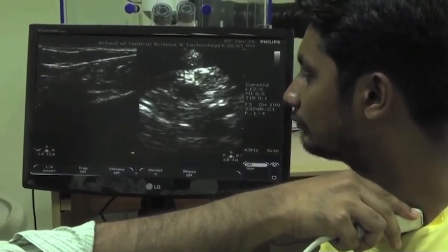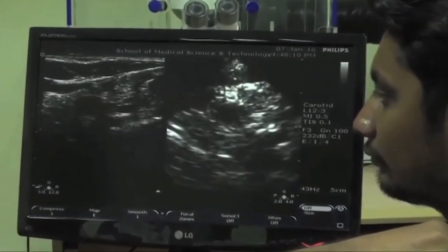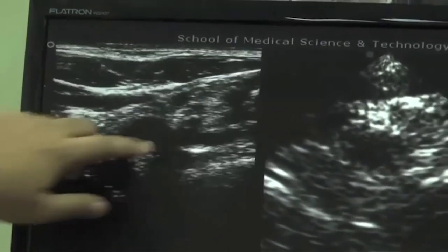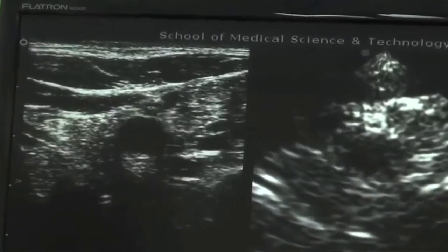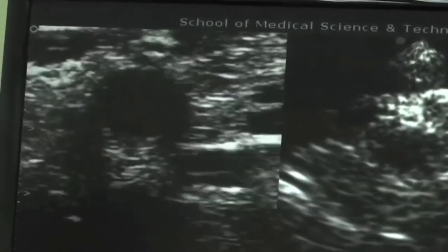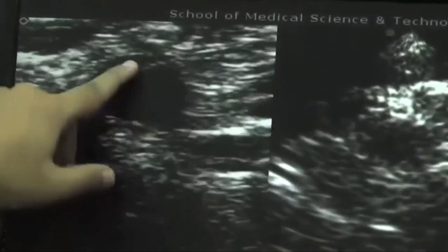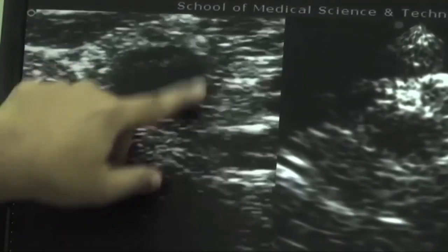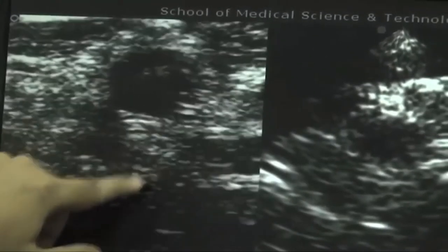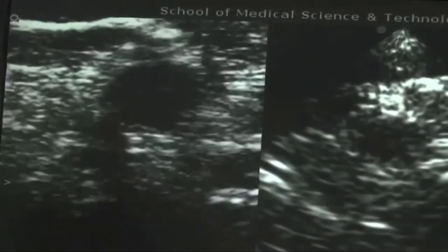And I increase the gain. I will have to change my mapping functions as well. So here is the carotid artery which I see on the linear probe. Okay. Now let's zoom into that. One of the interesting things is you will see beyond the carotid artery, this is where the artery is and the blood is flowing. You see this enhanced region. The speckles are much brighter, and that's called the enhancement. There will be a rim of shadows coming down over there, which is clinically relevant.